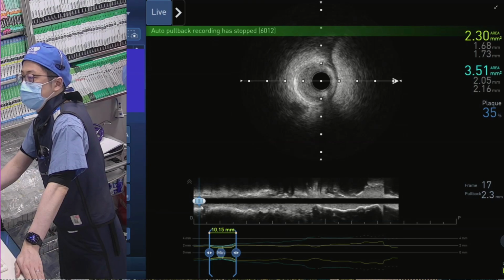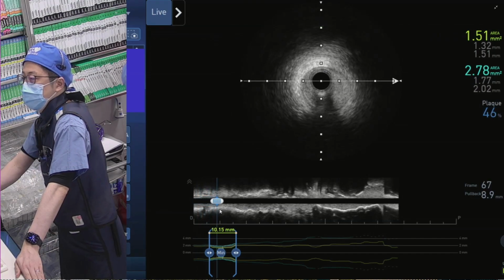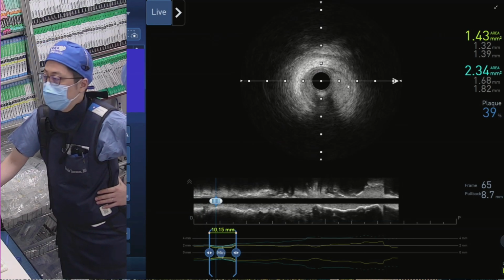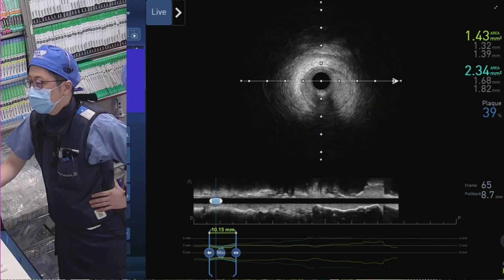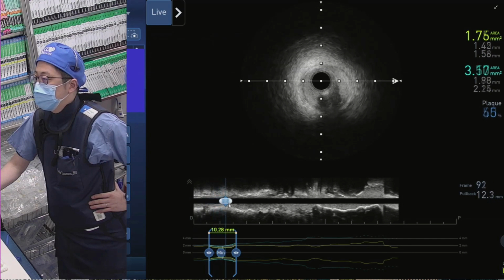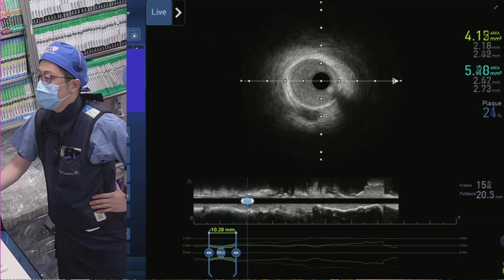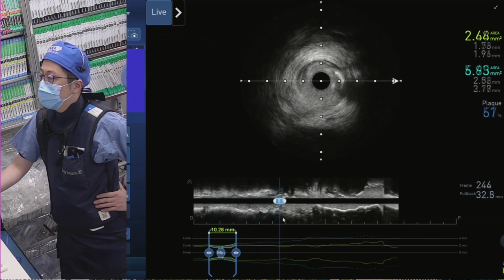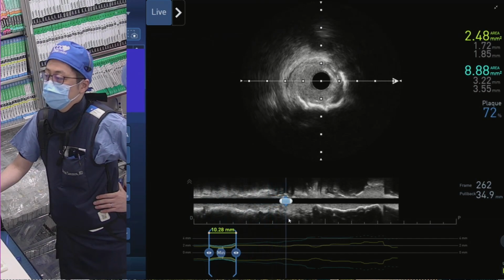This is like a 2.1 vessel, very small vessel. We use 2.5 balloon. Here looks like 3 o'clock. Here is a hematoma here. Tissue cover here. So this surrounding zone is going to be like a 2.2 vessel. Then mid to distal, as I told you, there's not much calcium actually. But around here, the calcium starts.